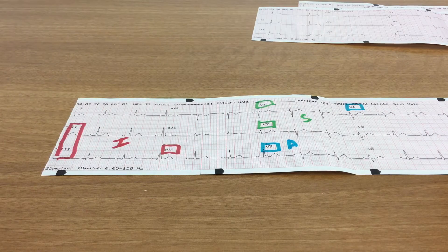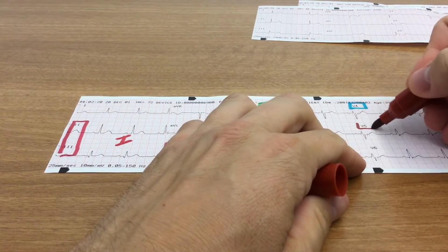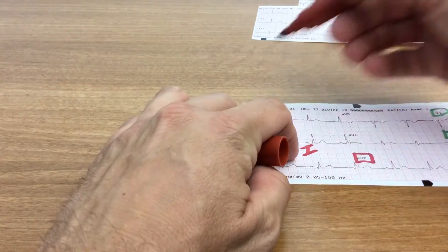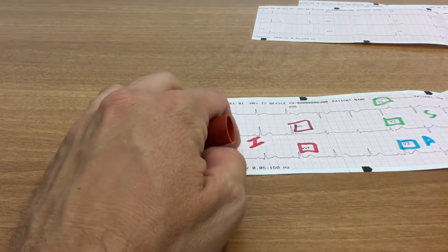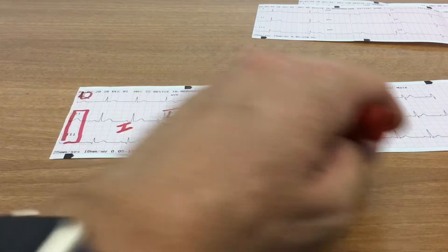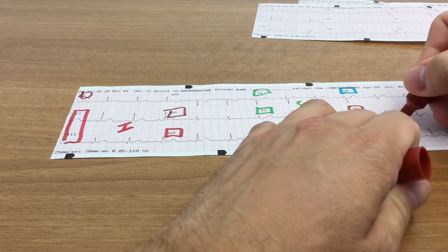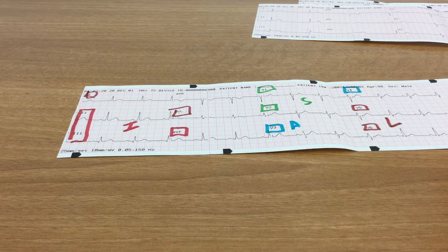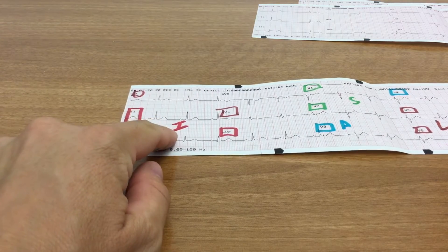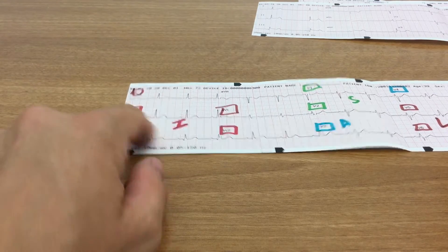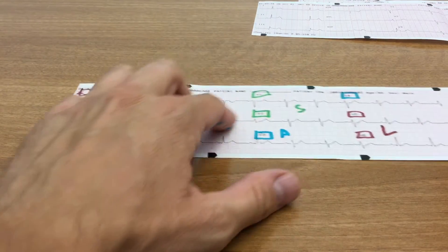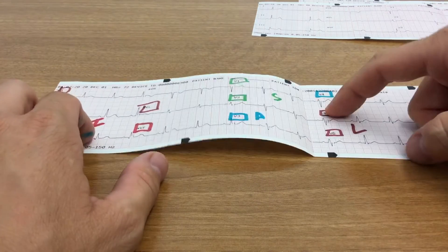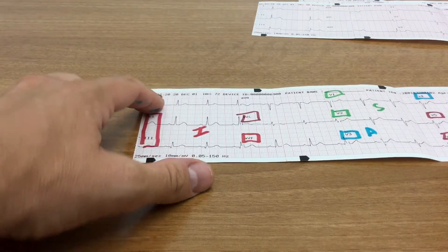And then that just leaves our leftovers with one exception, and the leftovers, V5, V6, 1, and augmented vector left, AVL. So V5, V6, 1, and AVL are the lateral wall, the lateral wall. So I, inferior wall, 2, 3, AVF. S, septal wall, V1 and V2. A, anterior, V3 and V4. L, lateral, V5, V6, 1, AVL.